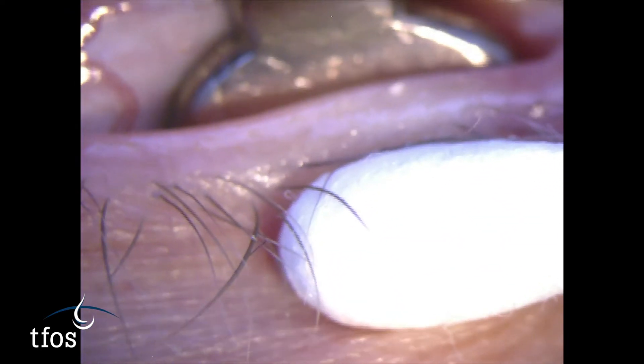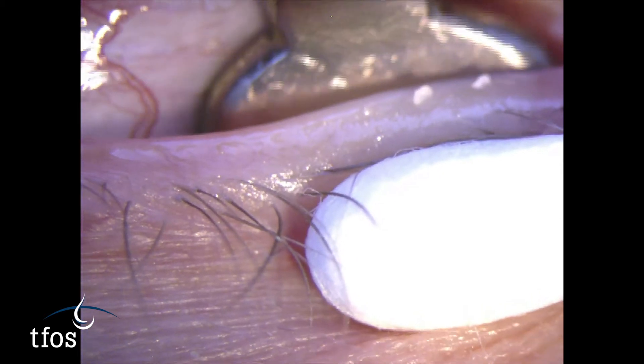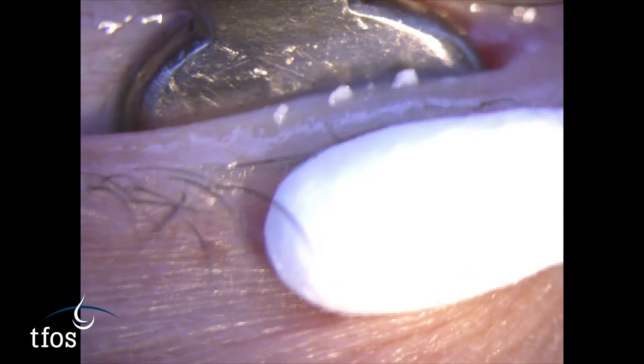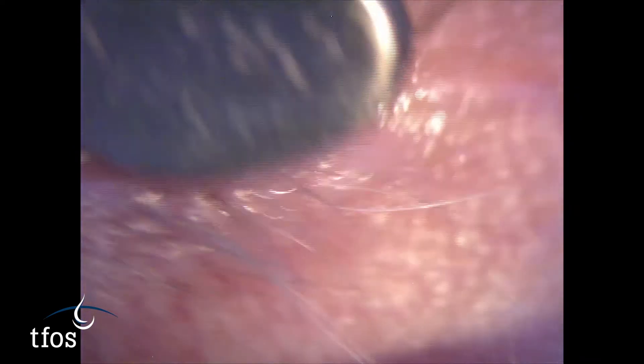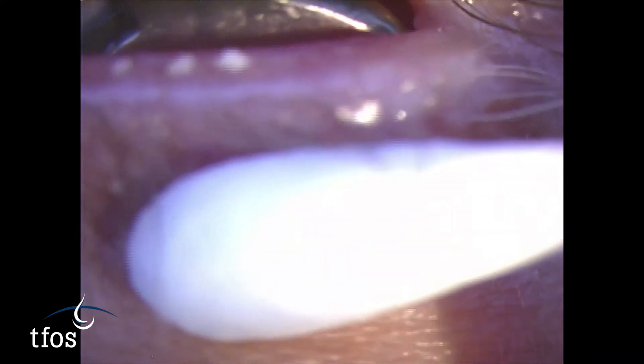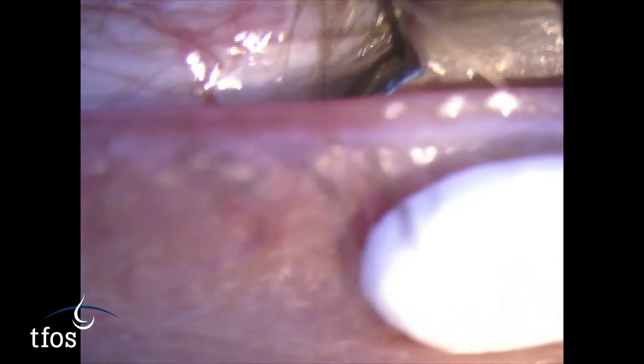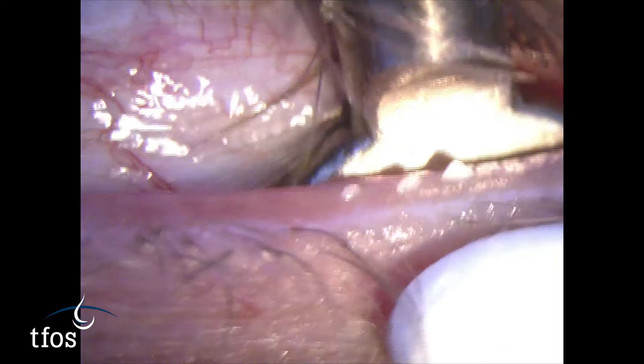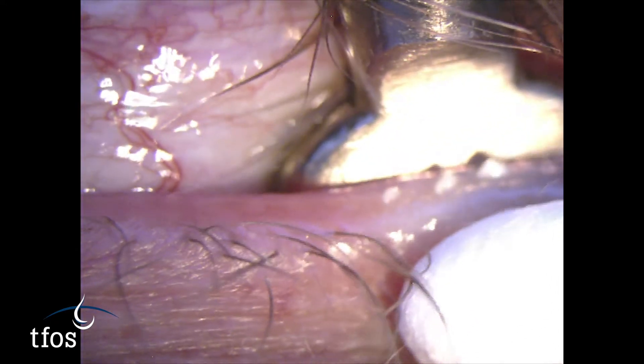While relatively firm pressure is often required, the force that can be applied will be limited by the patient's pain threshold, as this procedure is uncomfortable. Patients should be warned that tenderness of the eyelids immediately following the procedure is not uncommon, and that relief from discomfort symptoms tends to occur in the days following the therapy.